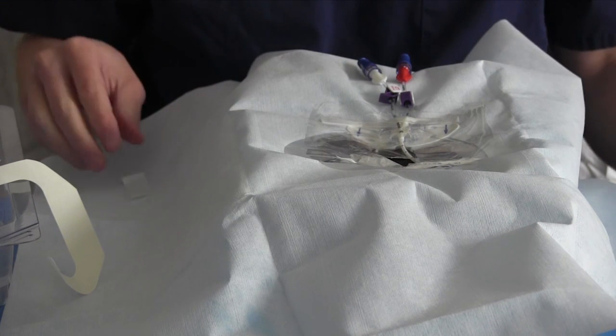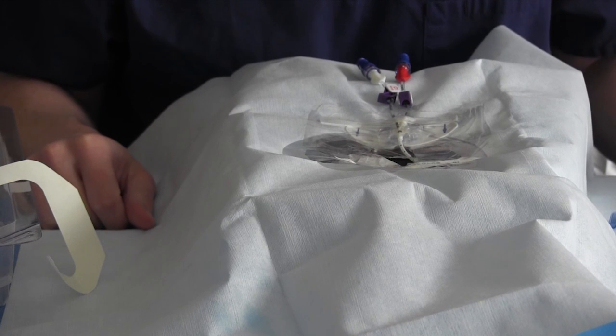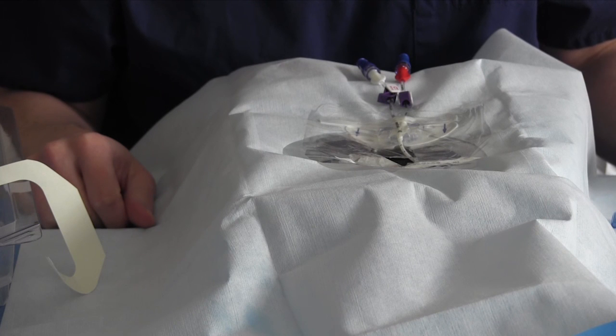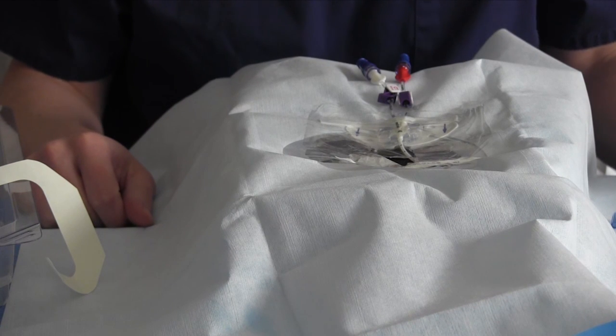You do need a procedure note. And on that procedure note, make sure you note where you cut the midline so that when people pull it, they know that the entire catheter has come out appropriately. And there you go. That's midline placement. Let's see it for real.